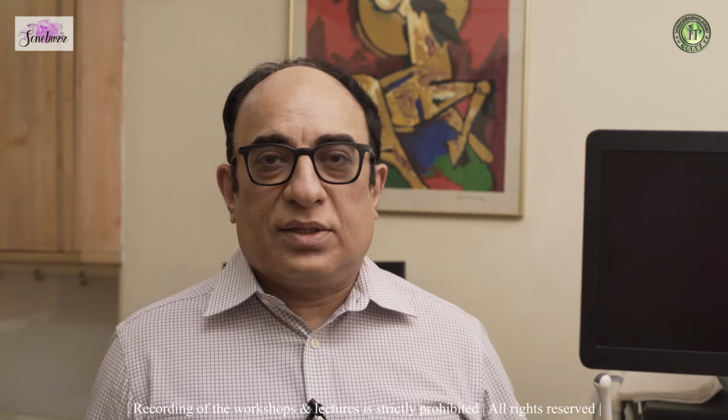We will be using the Voluson E10 new BT21 machine. We'll use the E8 and we'll use the Logiq E10 all G machines, and we'll show you different techniques of basic and advanced neurosonography, and hope you can use these techniques in your practice, and we'll show you some cases also. Thank you. Let's start.